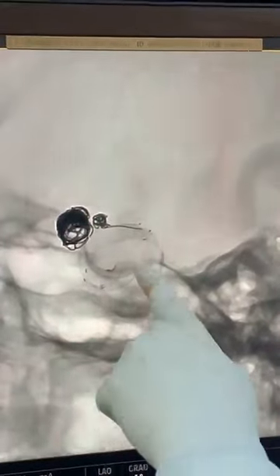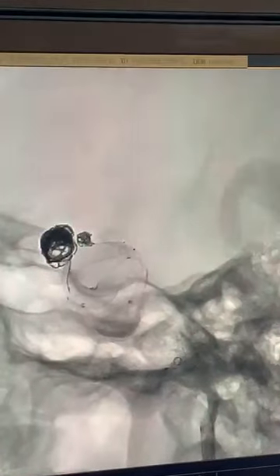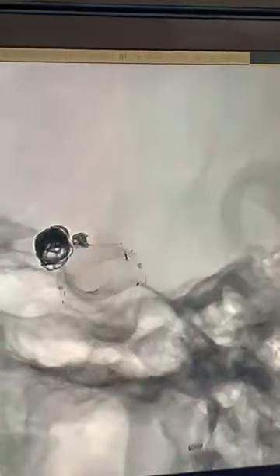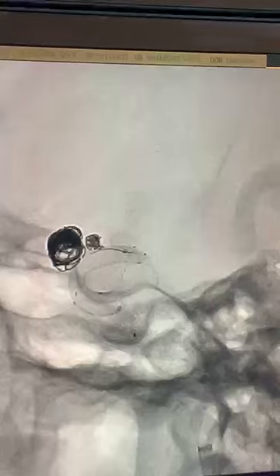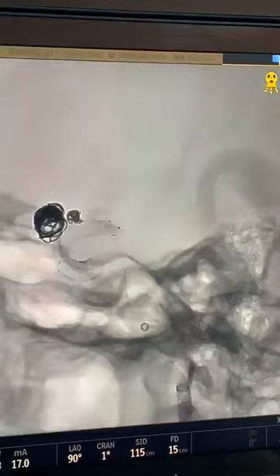This is the beginning and this is the end of the flow diverter. Understood or not? Yes. So you have deployed it beautifully in this tight siphon curve, which is very difficult to treat. The complexity of the case, stent in a stent, and also in a tight carotid siphon. And then we have taken this catheter for the massage, which will help the apposition even better. So now I will release the whole thing.